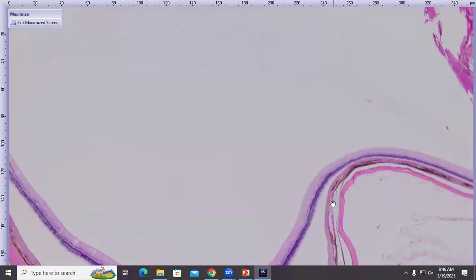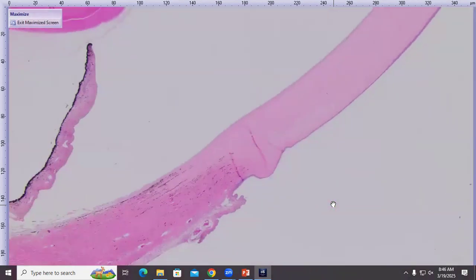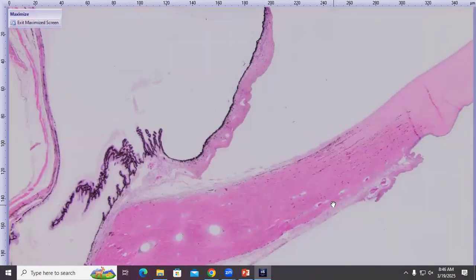All right. We've got cornea on our right. You can see that it's pretty normal. And we did have glaucoma in this case, and you can see from this low magnification that the ciliary cleft and iridocorneal angle are nice and open. You can see these nice, delicate, distinct, and individualized pectinate ligaments. We'll drop in on it closer in a bit, but this nice rarefied looking site here, which is trabecular meshwork, is also open and looking nice and normal.